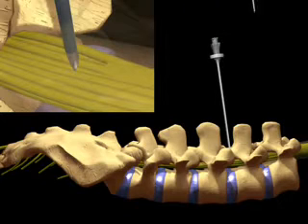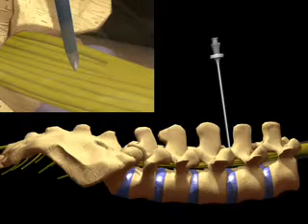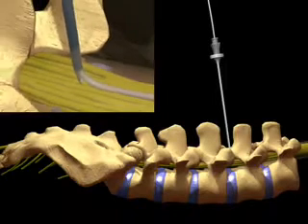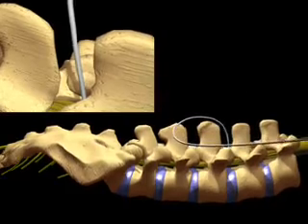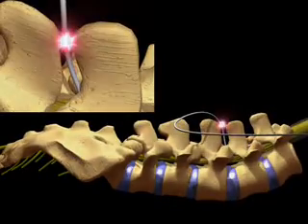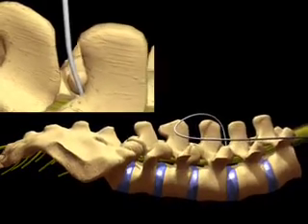The sharp bend in the catheter can also make withdrawal of the guide wire difficult in a catheter placed using a midline needle technique. Even if the catheter is successfully inserted and the guide wire withdrawn, catheter placement between the lumbar spinous processes or ligaments can lead to catheter failure.